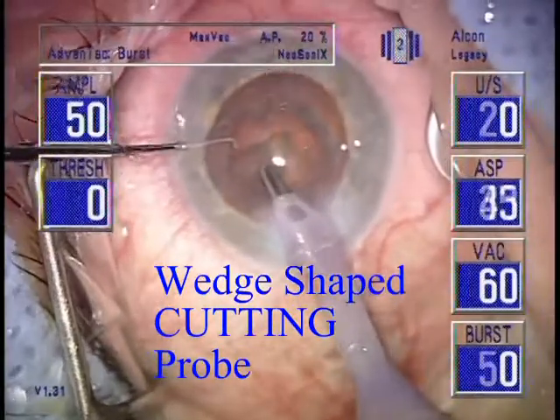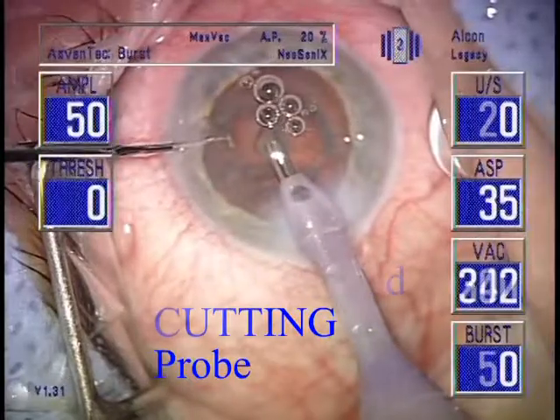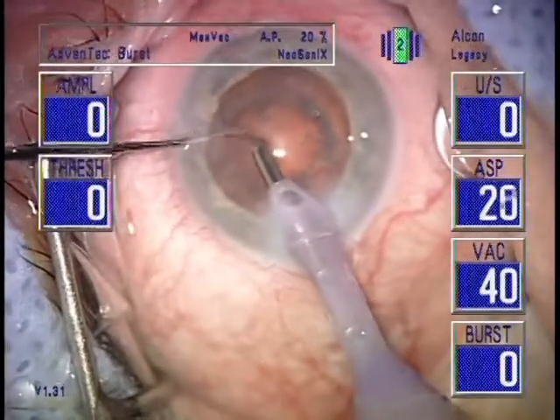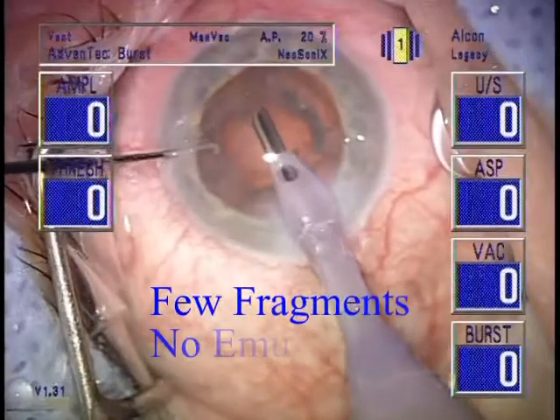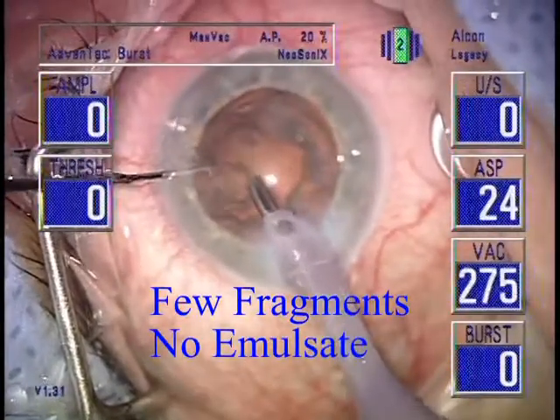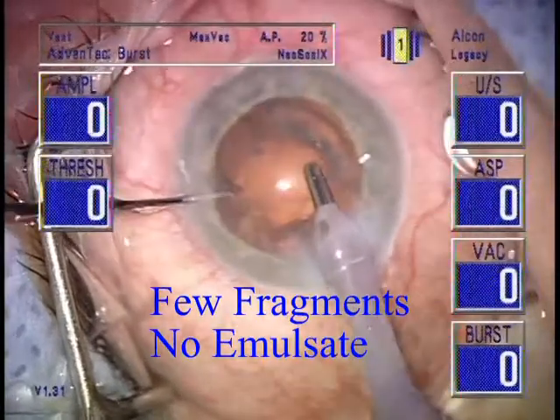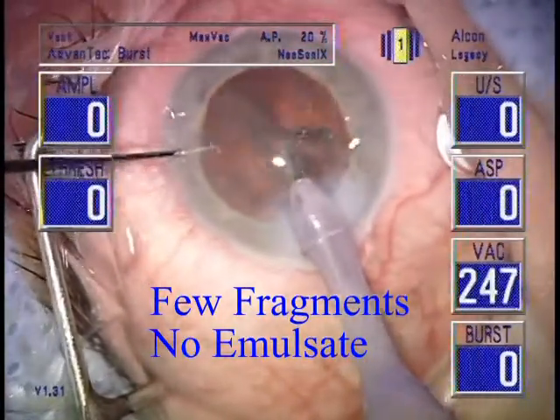Application of vacuum is like pushing on a trifine. Application of power is like twisting a trifine. With this cutting probe, there are very few loose fragments within the eye to potentially damage the endothelium. Also, there is no emulsate with this non-cavitational technique.